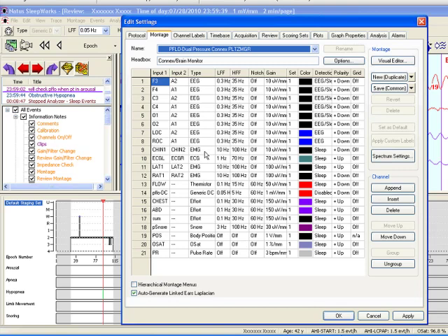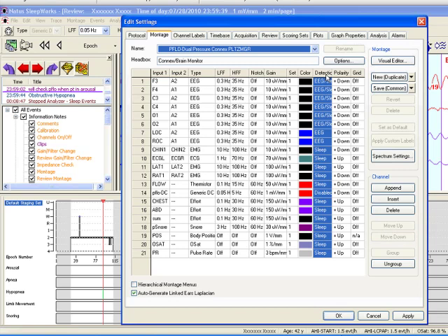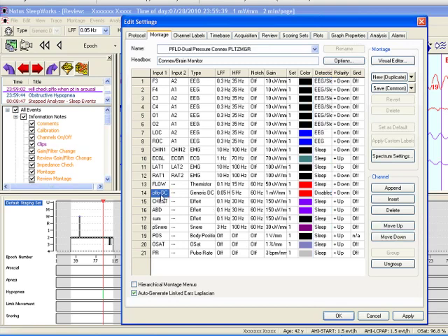the montage, and if the channel types are appropriate and the detection column specifies that they are for sleep or EEG or sleep, then it will look at it when it performs the analysis. So if I change this to use the as recorded montage, do you think this will work? Well, we wanted to look at P-flow, but I'm looking at this montage.